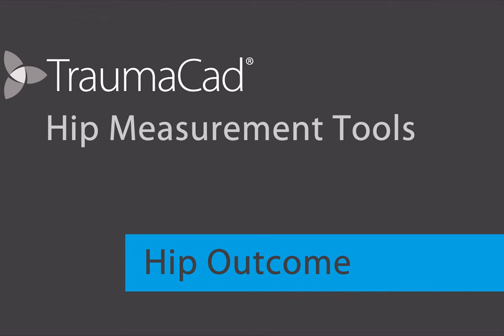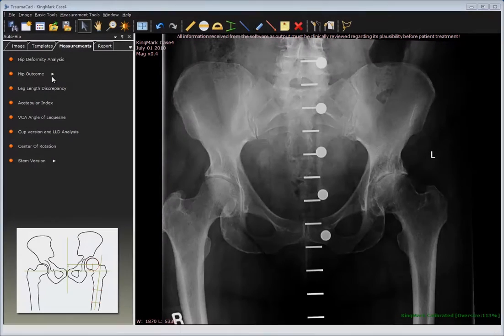The Hip Outcome tool is designed to compare the pre-operative and post-operative position of the center of rotation when a total hip replacement is performed. This tool serves for quality assessment and helps evaluate the accuracy of the reproduction of the center of rotation, which is one of the major aims when performing a total hip replacement.